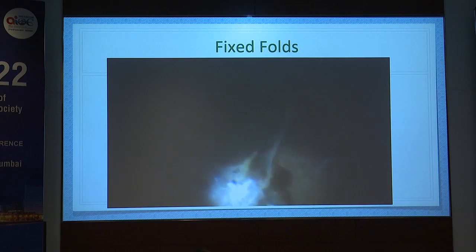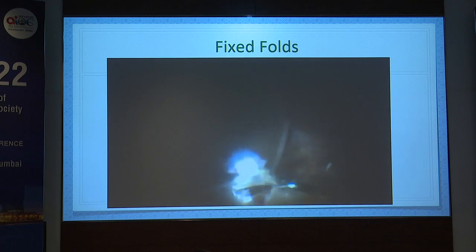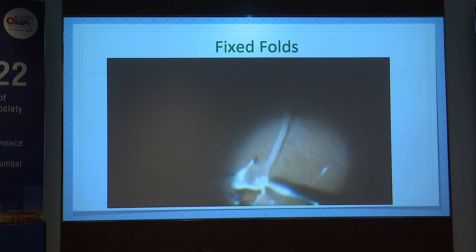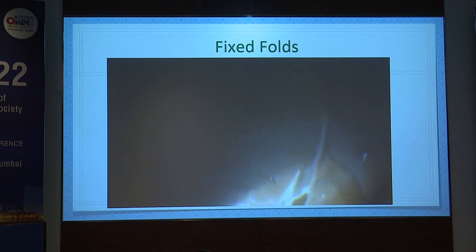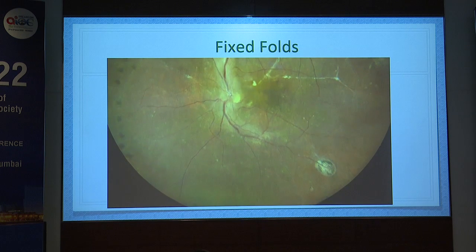Now in this case we have managed to do the dissection around the disc perfectly well, but if you see, as we are doing the dissection in the periphery, there is a regma that occurs, and now the regma has to be totally disconnected from the vitreous, and only when you totally disconnect that particular regma from the vitreous, you can be assured that this patient is going to do well. And this is the post-operative picture of this patient.